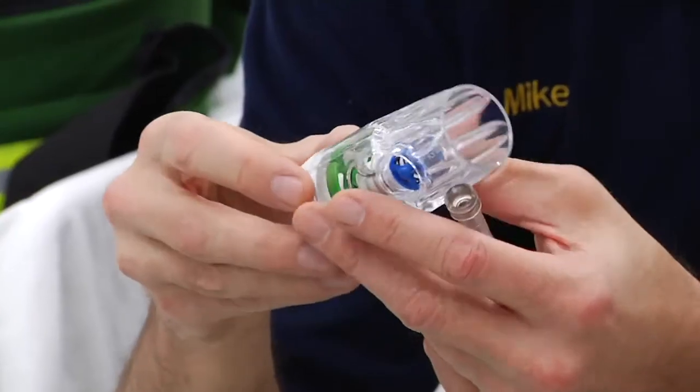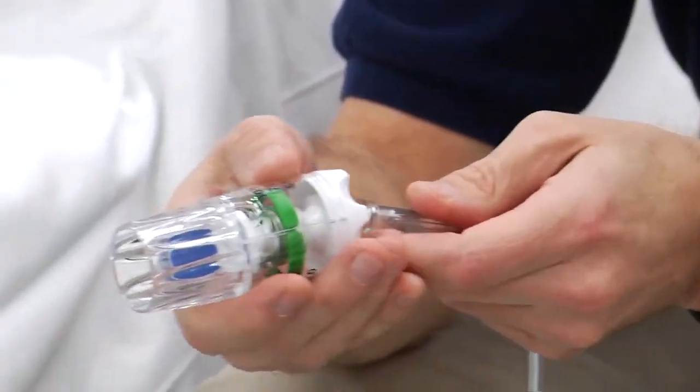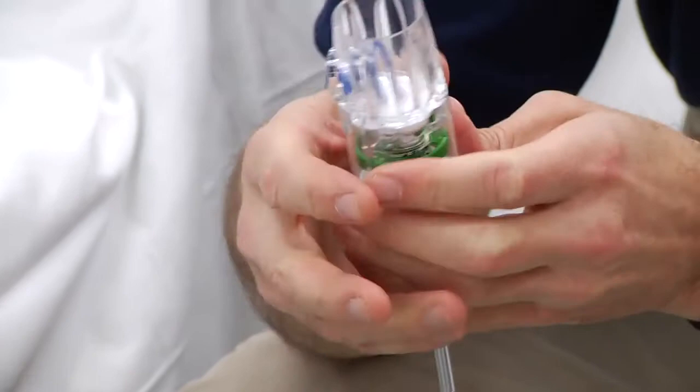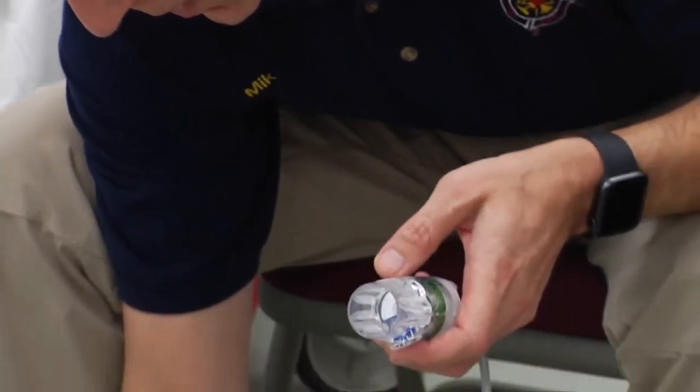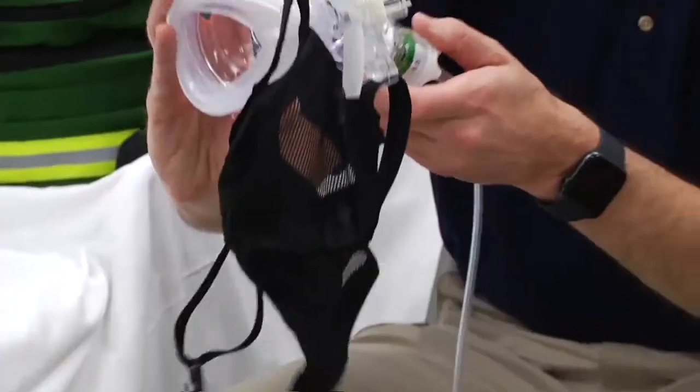So lower pressures are used initially because of the uncomfortable nature of CPAP. If you were to put high pressure on somebody instantly, they're not going to do well with keeping the mask on. So we'll start at a low pressure, 5, 8, maybe 10 centimeters of water pressure. In this case, I'll set the device at 7.5 centimeters of water pressure. I'll plug the oxygen tubing into the CPAP device. I'll turn the device on to the 10 liters a minute that it says to use, and then I'll attach it to the mask.